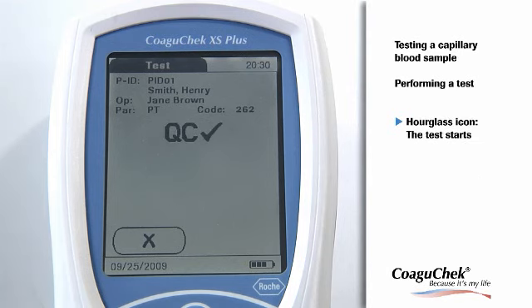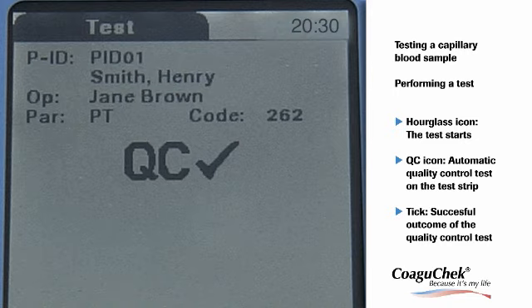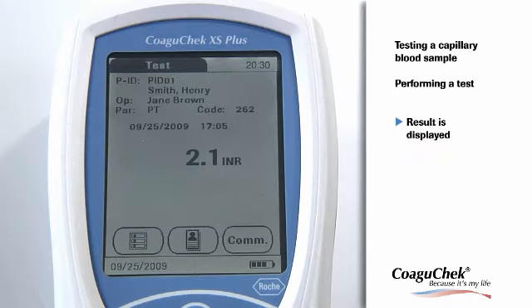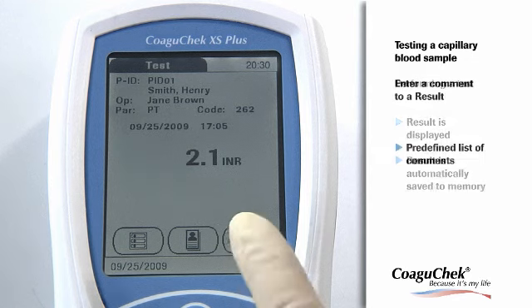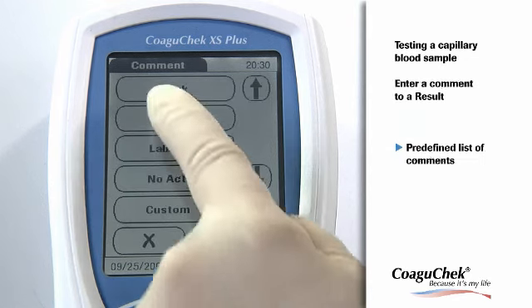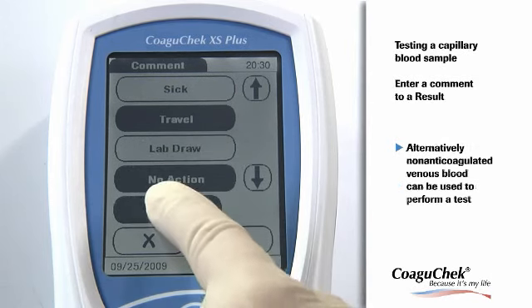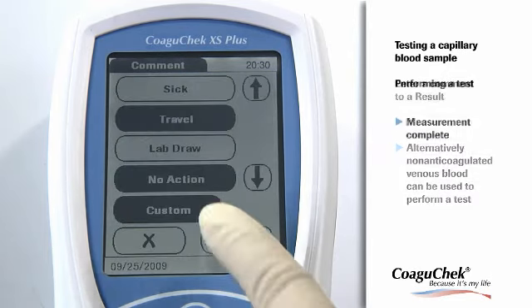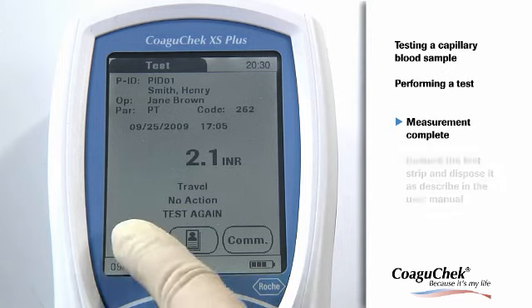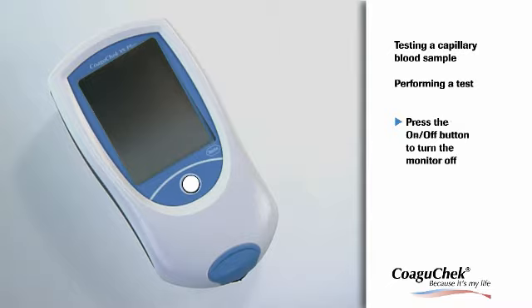The meter performs an automatic quality control test on the test strip. After a successful onboard quality control, QC and a tick appear in the display. The result is displayed and it is automatically saved to memory. By pressing the comment button on the results screen, you can assign up to three predefined comments to an INR result. The custom button at the bottom can be used to enter free text of up to 20 characters. You have successfully completed the measurement. You can now remove the test strip from the measurement chamber and turn the meter off.